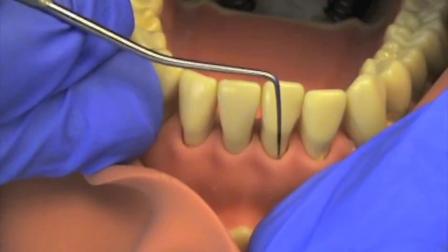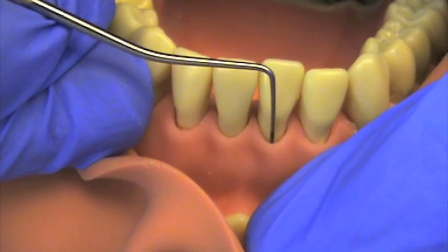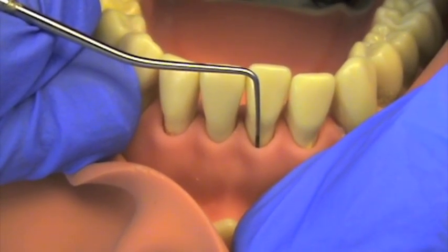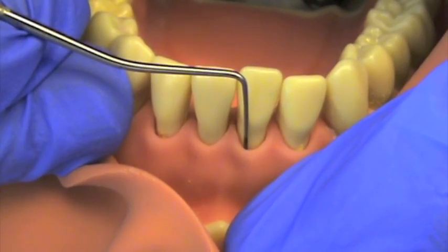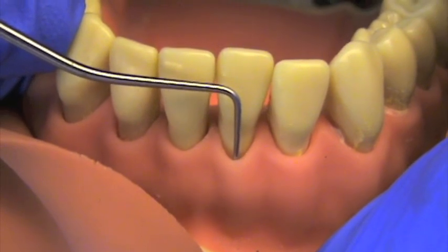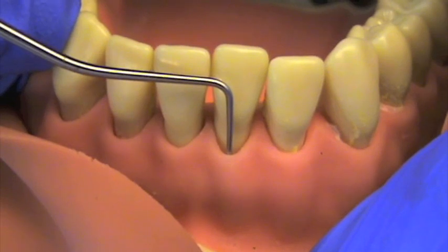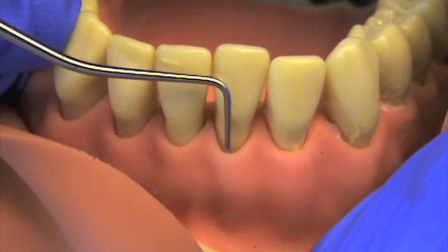At code 3, you can see that the black band is partially visible. That would mean that there is a pocket depth of between 3.5mm and 5.5mm. At code 4, the entire black band disappears and is entirely within the pocket. This indicates a pocket depth of 5.5mm or more.